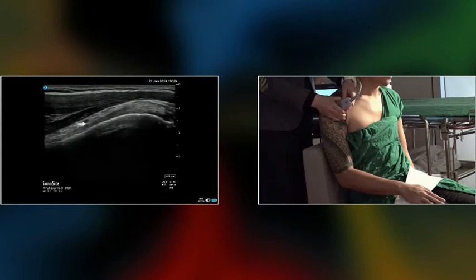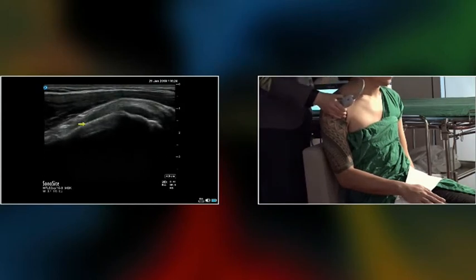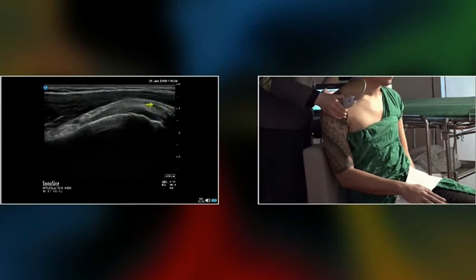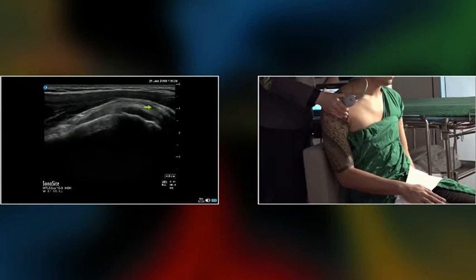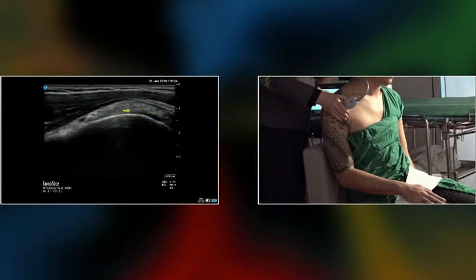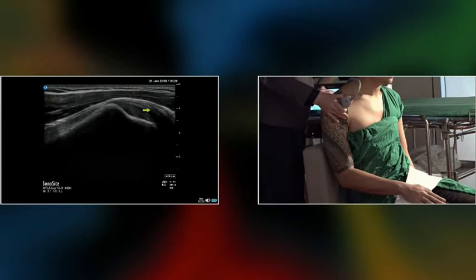And scan done. Okay? So you can see nicely the tendon. If people have a thin bursa, I don't regard this as having any pathologies. A little bit of rim of bursa shows as hypodensity. Okay, this is the bursa, very beautiful. And at the attachment, in people having tendinopathy, you will see there is a patchy echogenicity along the tendon, and you couldn't see the nice fibrillar layers.